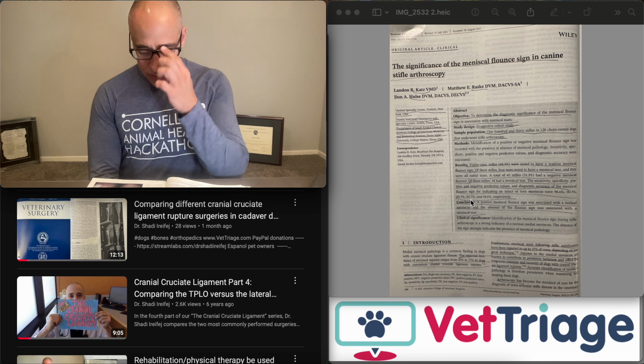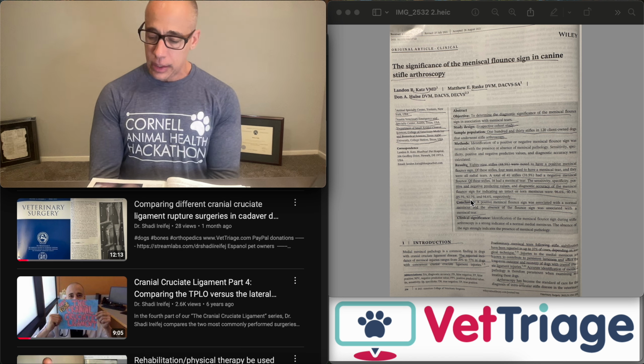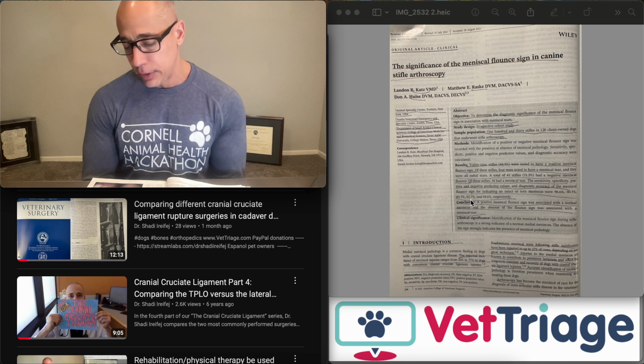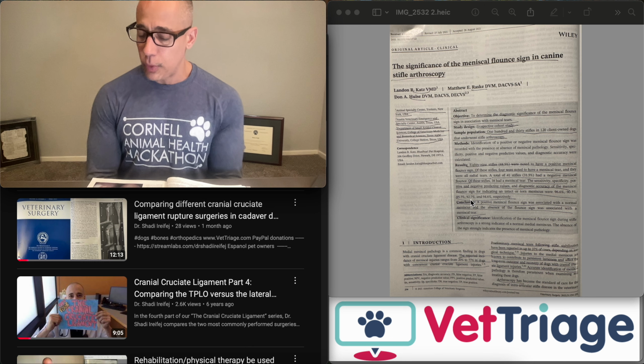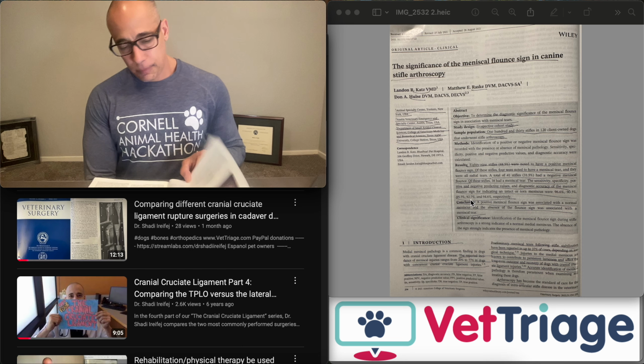All right, materials and methods. This study occurred between February of 2018 and November 2020. They used a 1.9, 2.4, 2.7, or 4.0 millimeter 30 degree forward oblique arthroscope with a video capture system, and everything else was pretty standard.